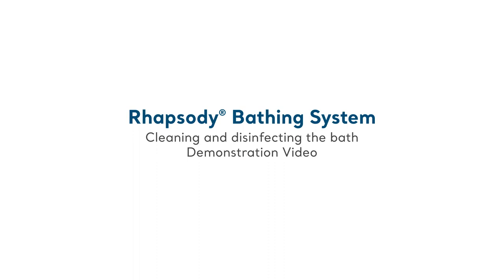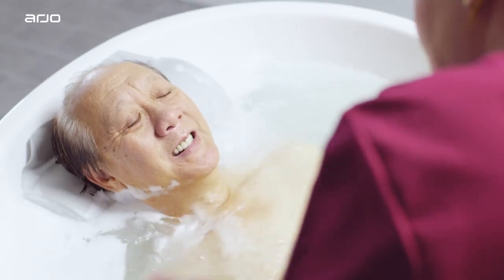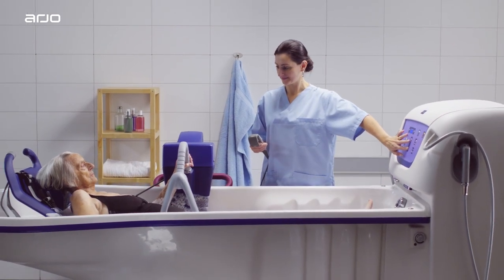Thorough disinfection routines are necessary to prevent the build-up of bacteria on and in the System 2000 bath. This is particularly critical in shared facilities where the bath will be used by multiple residents. To prevent cross-contamination, adhere to the following guidance.